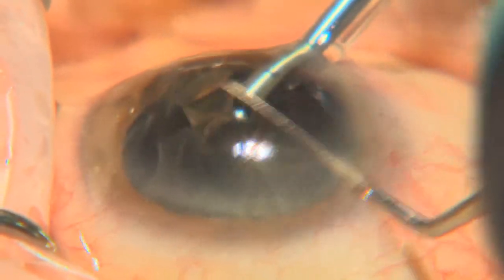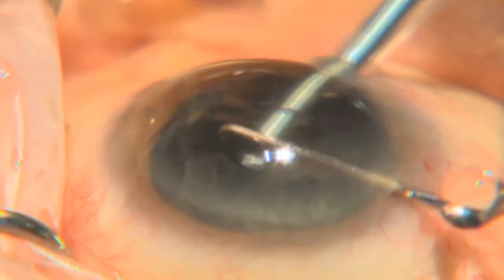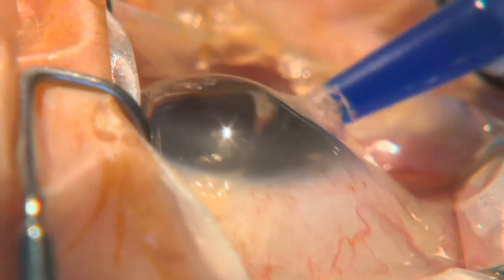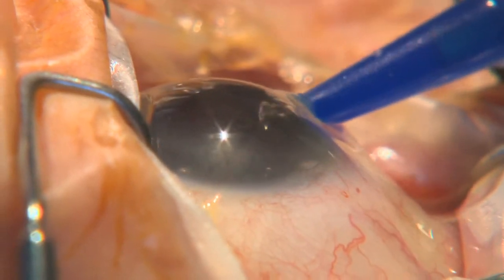The incision puts pressure on the silicone sleeve and does not allow precise control, unlike a 2.0mm opening. In my opinion, a 2.0mm incision is perfect, and the biflex lens is perfectly suited to 2.0mm surgery, as it was designed to be injected with smaller diameters down to 1.6mm.